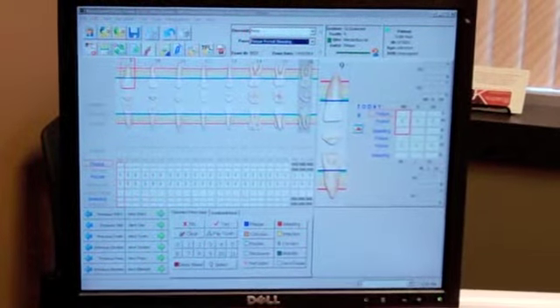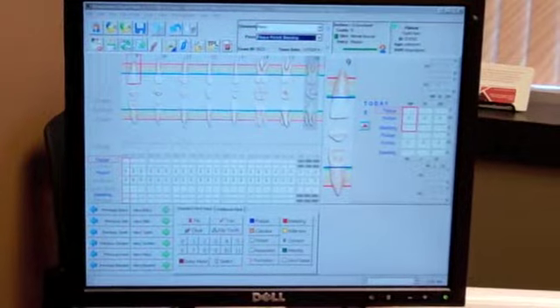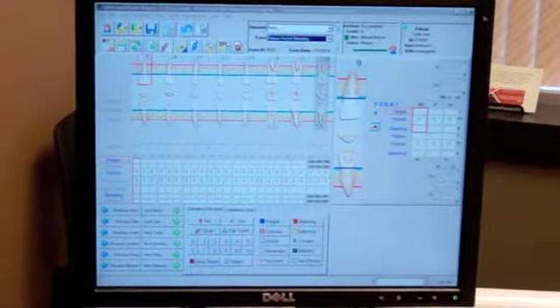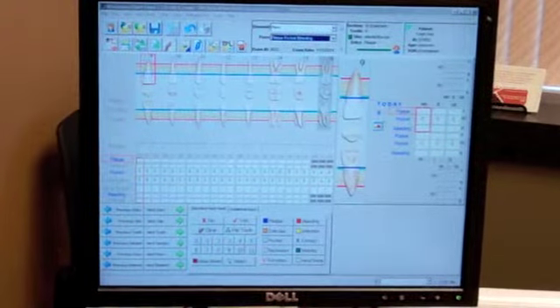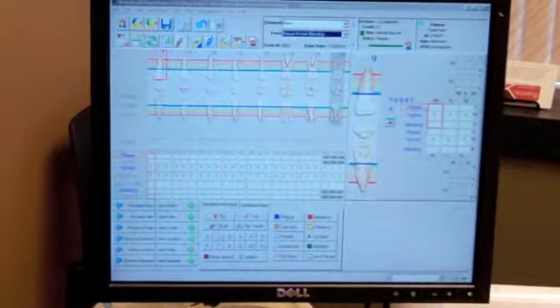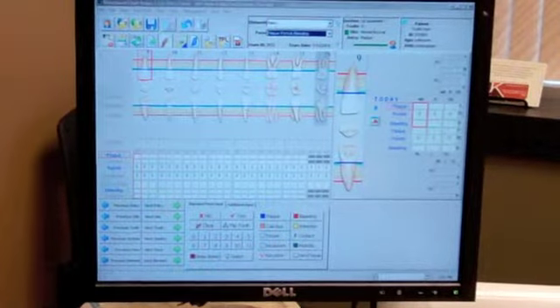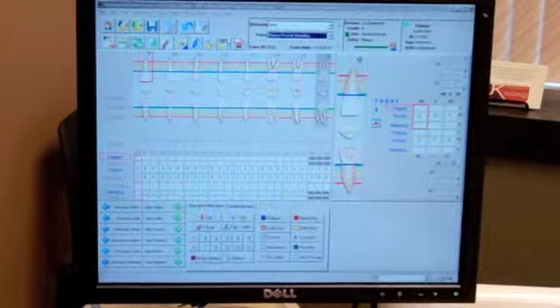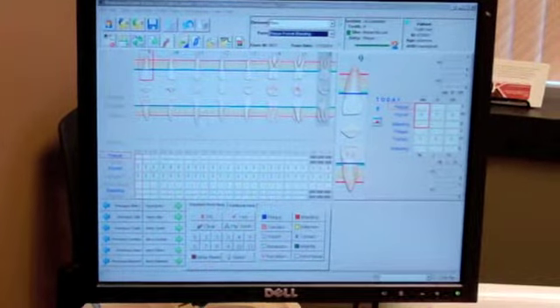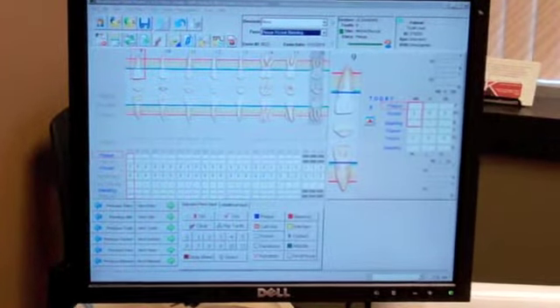Now at this point, before I say stop listening, I always say the word save, to make sure that it has saved what I already recorded. I'm at the halfway point now for the maxillary. I stop and I ask the patient, any questions? Yes, what does that all mean so far?